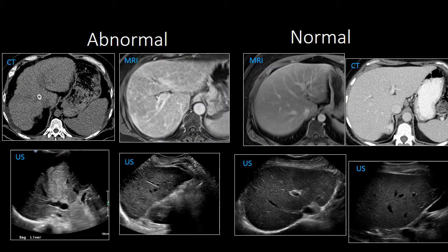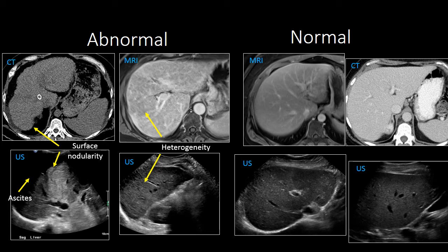Here are some examples of cirrhotic livers and normal livers on CT, MRI, and ultrasound. In the cirrhotic livers, we can see surface nodularity and a heterogeneous texture to the liver parenchyma. We can also detect ascites in a few of the cases. Compare those to the normals on the other side, where the liver parenchyma looks very smooth and there is no surface nodularity.